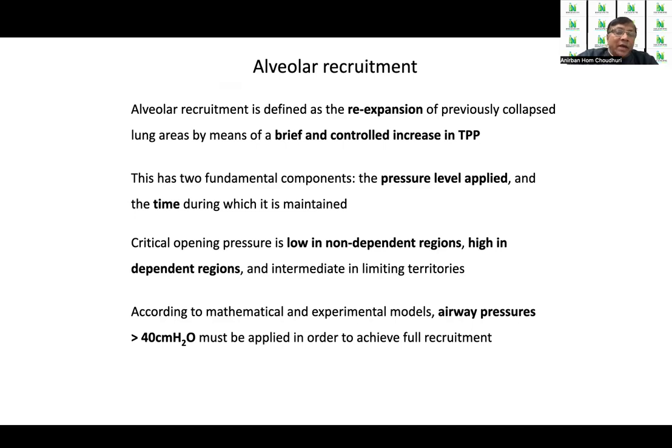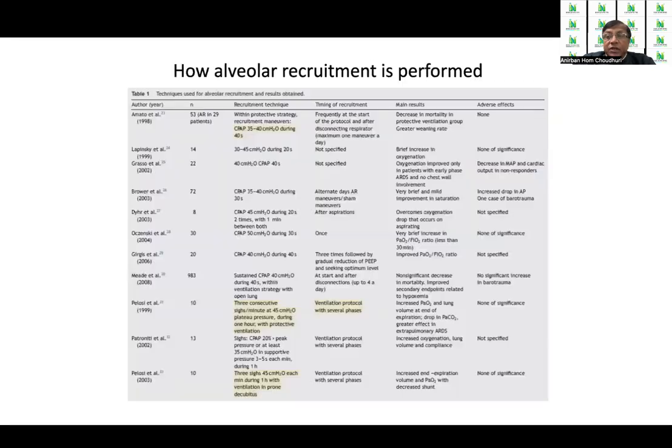According to both mathematical and experimental models, airway pressures of more than 40 centimeters must be applied to achieve full recruitment. However, it is not always possible to give more than 40 centimeters because of the other side effects which are associated with PEEP.